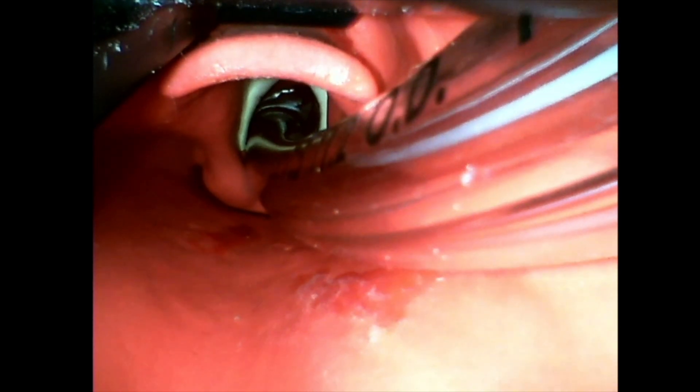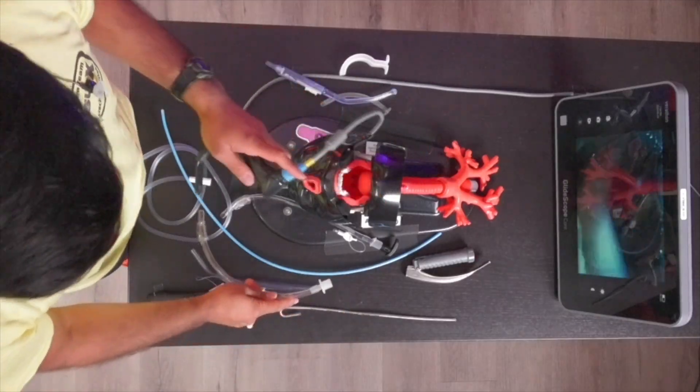Let's get the front camera now. These are the patients for which you really have to be comfortable with front of neck access. Surgical cricothyroidotomy may be the only way to secure an airway on a patient with a contaminated airway. The easy part is you only need four things: a number 10 scalpel, a finger, a bougie, and a 6.0 ET tube. It's very simple: scalpel, finger, bougie, tube.